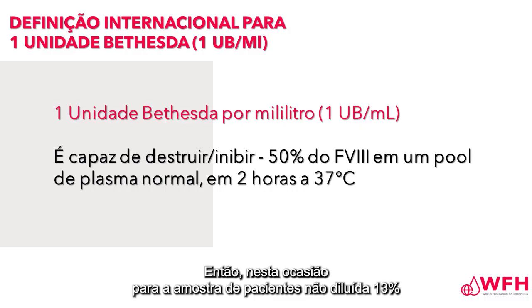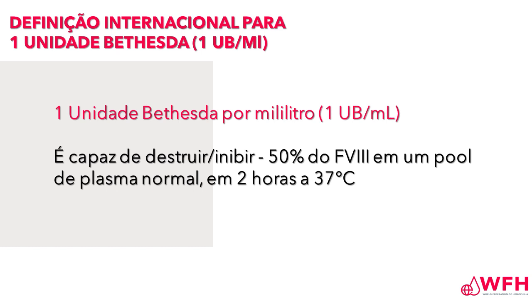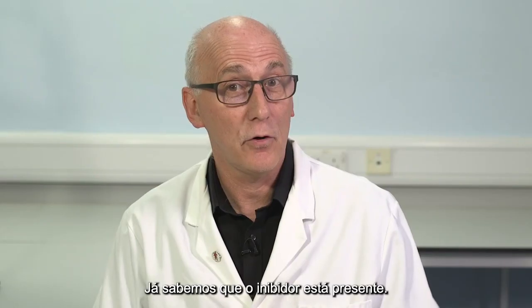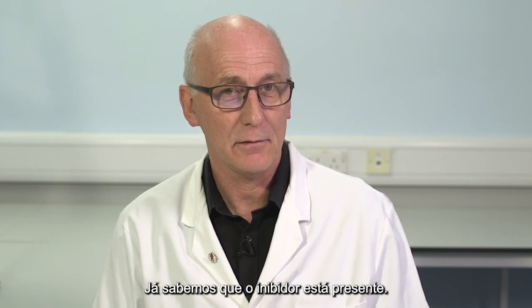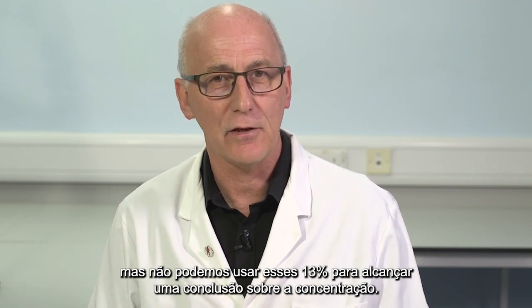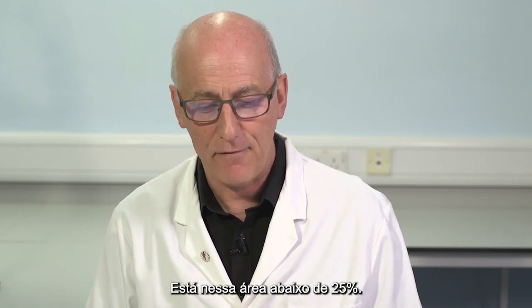So on this occasion, for the patient sample undiluted, 13%, significantly below that figure of 25. We know we've lost a lot of factor 8. We already know that inhibitor is present. Clearly there's quite a strong inhibitor. Majority of the added factor 8's been destroyed. But we can't use that 13% to reach a conclusion about the concentration. It's in that area below 25.